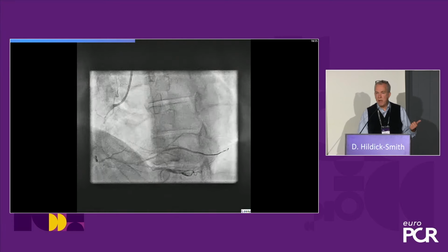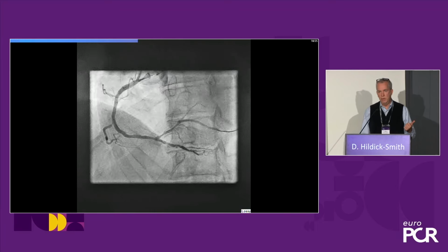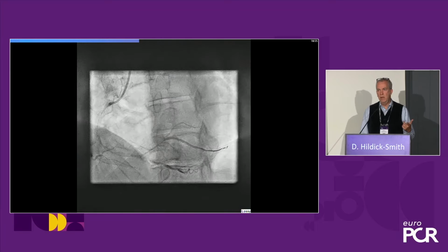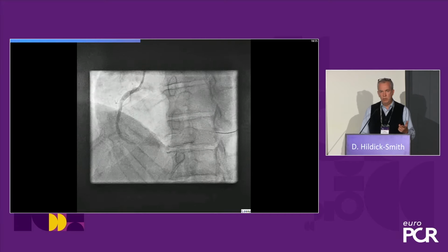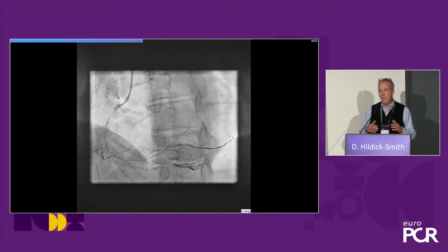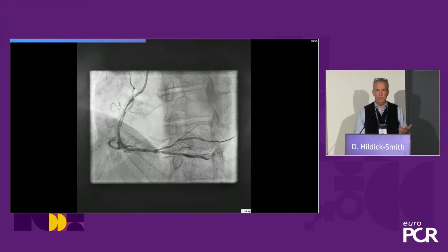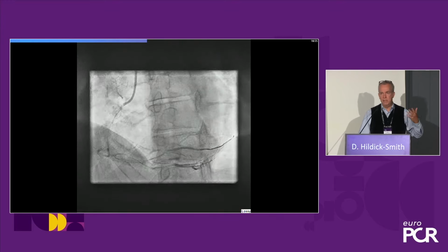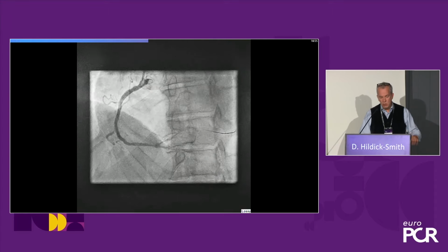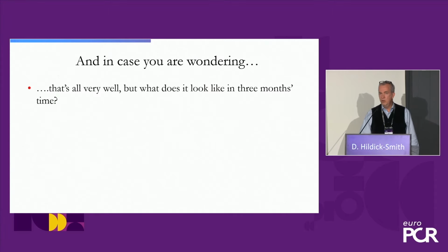Now, the patient is spared agonizing over the duration of long-term antiplatelets. They've got their rheology of the vessel restored, maybe endothelial function. You haven't got risks of malapposition. You haven't got risks of stent thrombosis. You haven't got to manage with the orthopedic surgeon what you do around their antiplatelets when they need a hip replacement. So, you know, I must say it was, for me, quite a revolution.